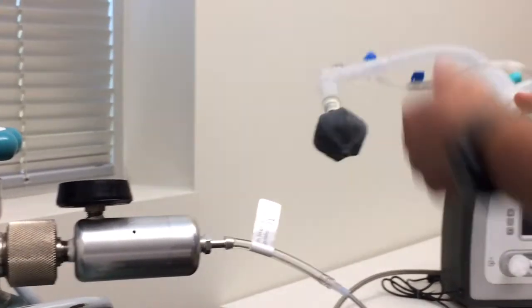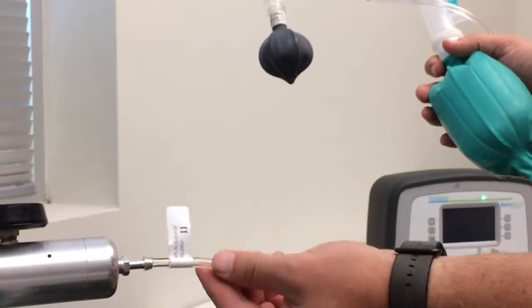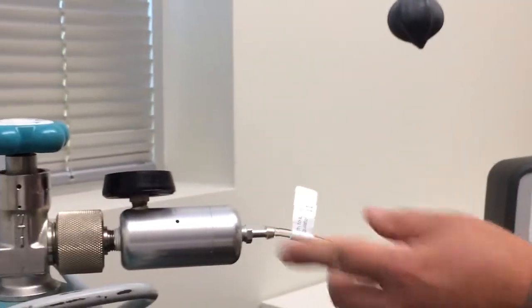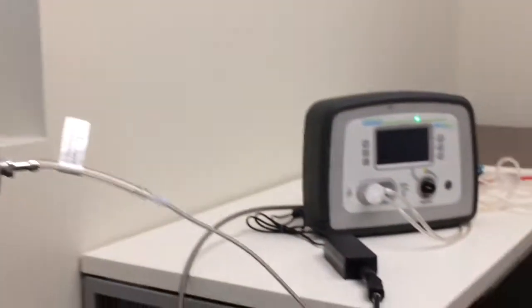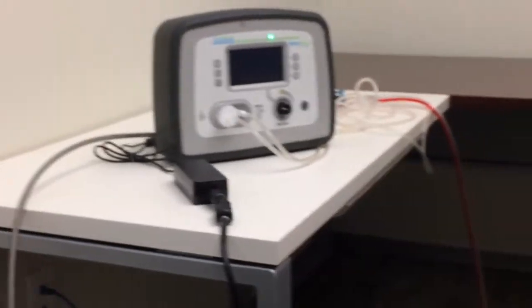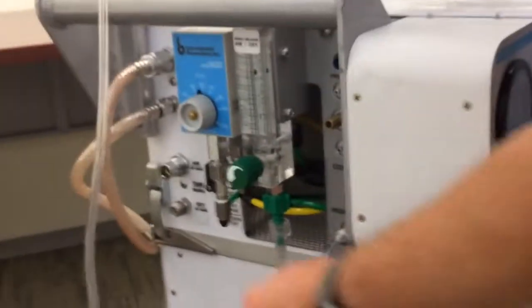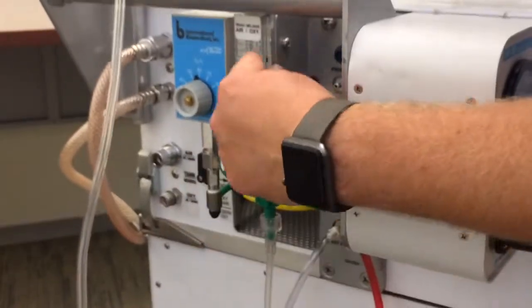We make the special bags that have the tube that attaches to the nipple on the regulator. The other part of the bag hooks to the flow meter. You set it at 10 liters per minute.